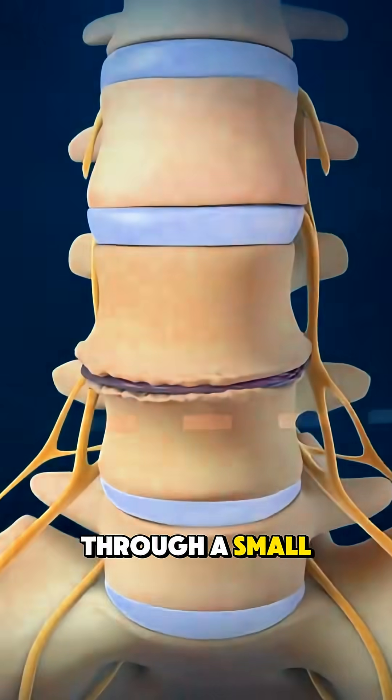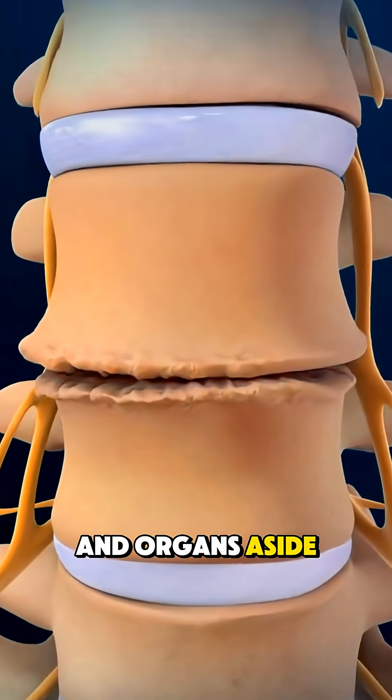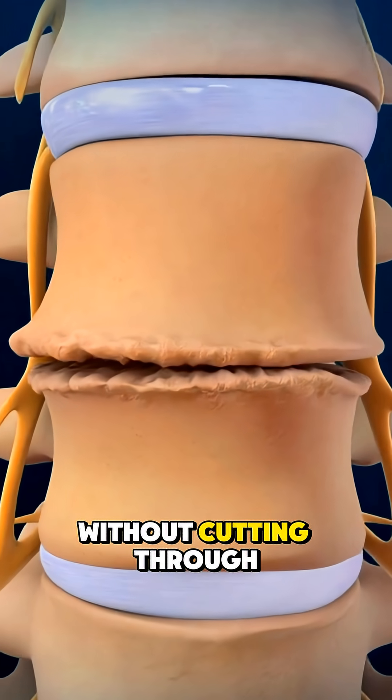Instead of operating from the back, the surgeon usually approaches from the front of the body through a small incision in the abdomen, gently moving muscles and organs aside to reach the spine without cutting through back muscles.